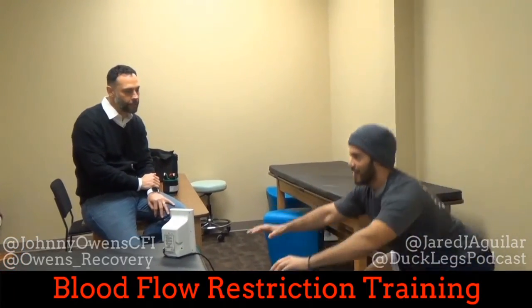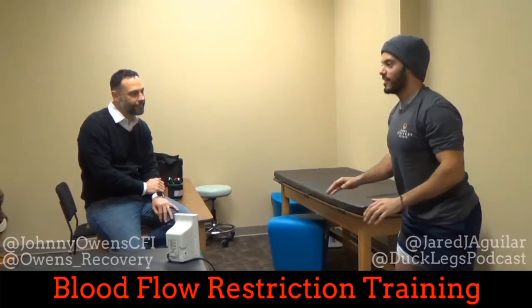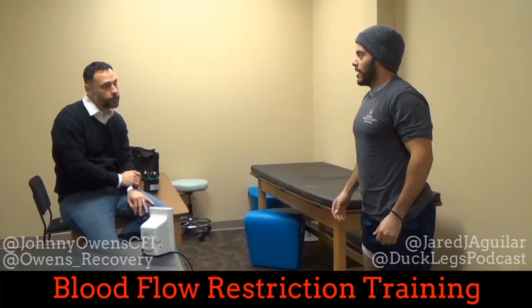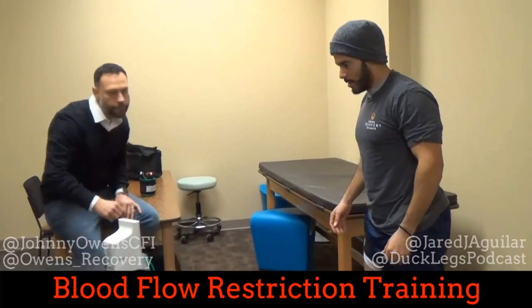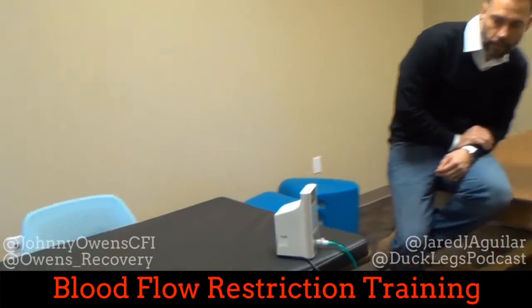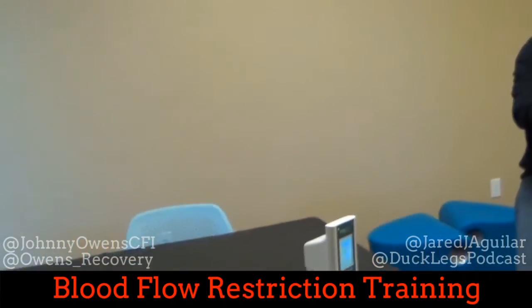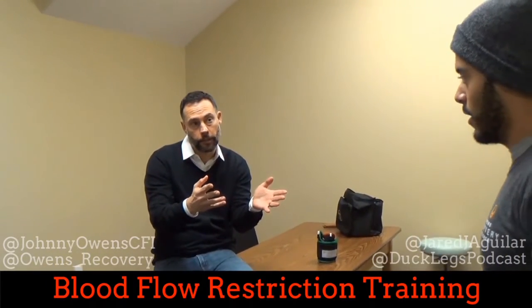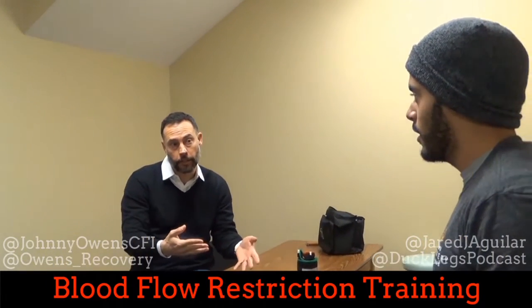We've got an exercise counter — this is about 30. Now it's a 30-second rest, and during this rest period we are still blocking. So your body is still thinking it's under a little bit of stress because it's not allowing oxygen in there. Your body doesn't know if you're doing 500 squats, have a crazy tourniquet on your leg, or are running from a dinosaur to save your life.